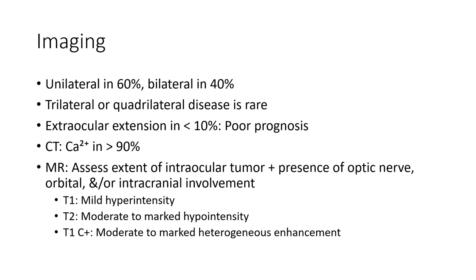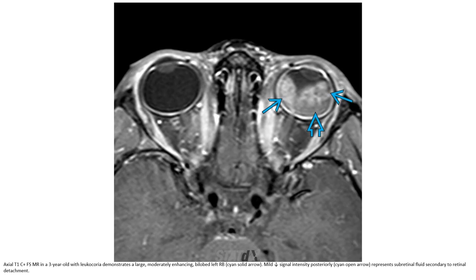On MRI: T1 shows mild hyperintensity; T2 shows moderate to mild hypointensity; T1 with contrast shows moderate to mild heterogeneous enhancement. Case example: MRI with contrast in a three-year-old with leukocoria demonstrates a large, moderately enhancing left retinoblastoma. Mildly hyperintense signal posteriorly represents subretinal fluid secondary to retinoblastoma.